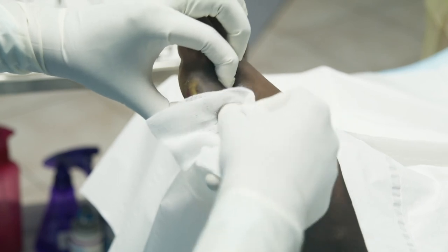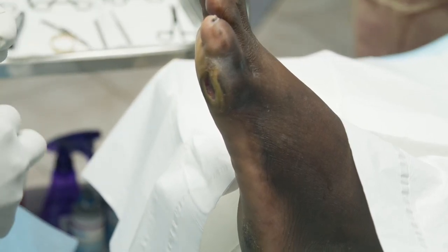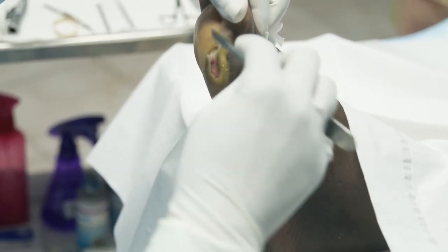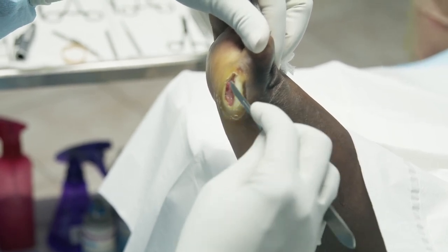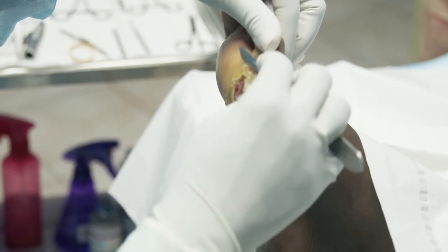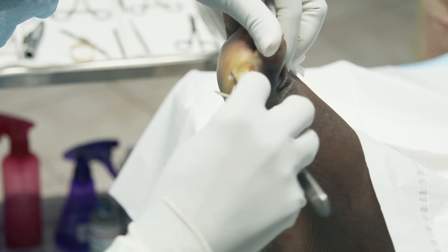And you dress these and dress these and dress these, man, and ain't nothing happening. And the patient begins to think, oh, one of these people know what they're doing, because the dressing routine is taking over my life. And what a proof of concept now for us is we go in here and take all of this dead skin away and decompress the wound, not externally, but internally. Okay, so we're changing the dynamic of the wound from the inside. And this is based on his pressure gradient because the fifth metatarsal head is penetrating. It's coming through this wound, literally coming through.